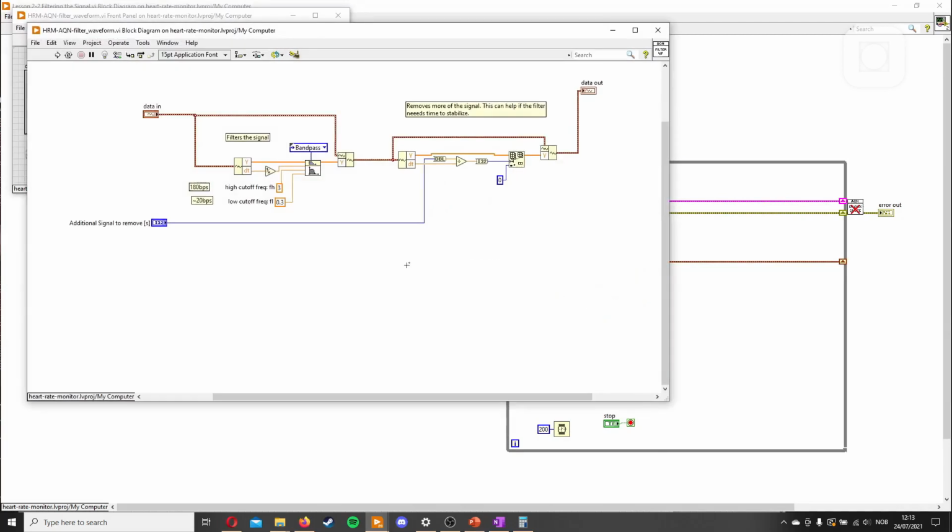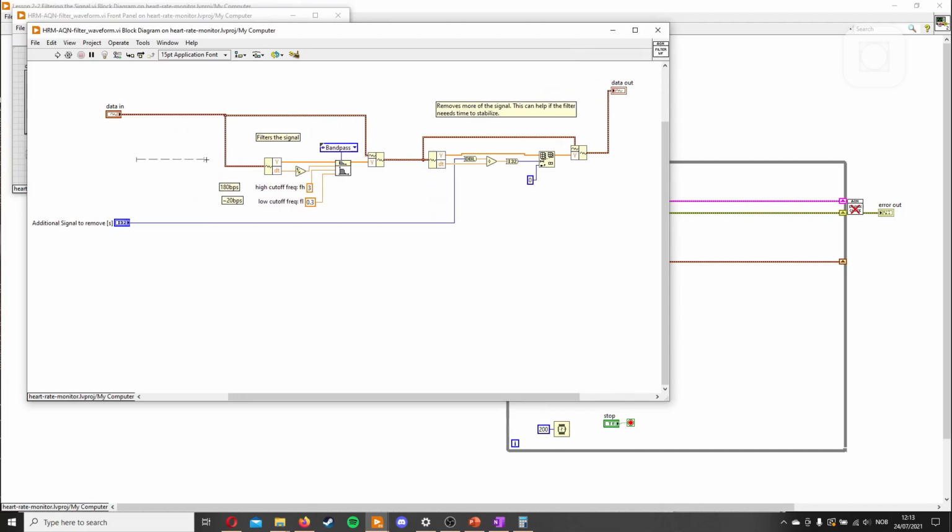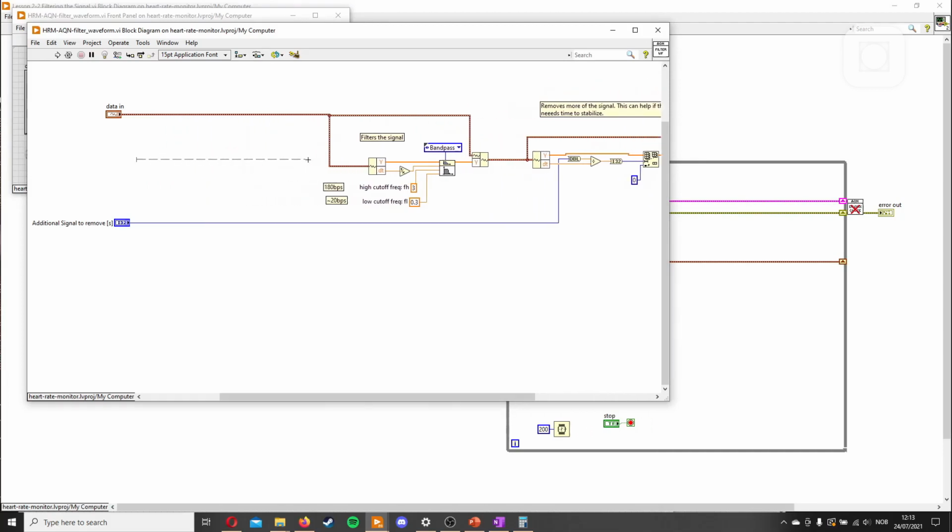So let's go back here again. A solution to this is something called padding. There's different ways to pad signals, but for this one, we'll try to do it in a sneaky way. So you saw that the filter uses 5 seconds to stabilize. So what we want is to kind of just make it stabilize and then remove it. We can do this by duplicating and reversing the signal, and I'll show you how.